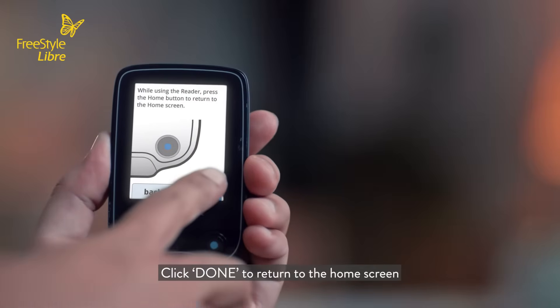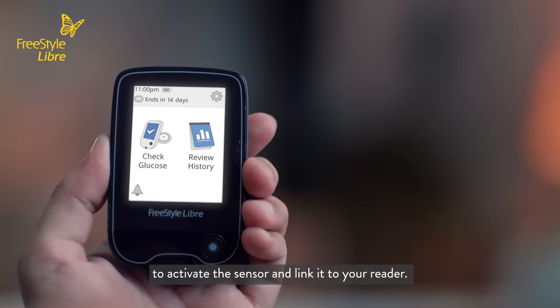Click done to return to the home screen and to activate the sensor and link it to your reader.